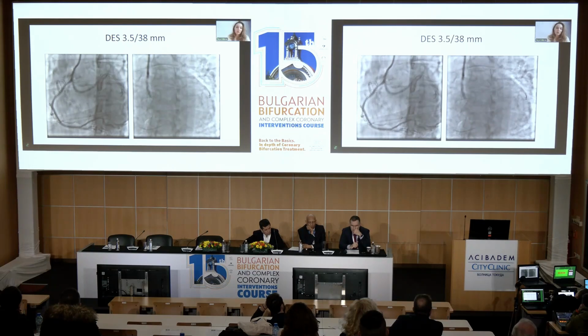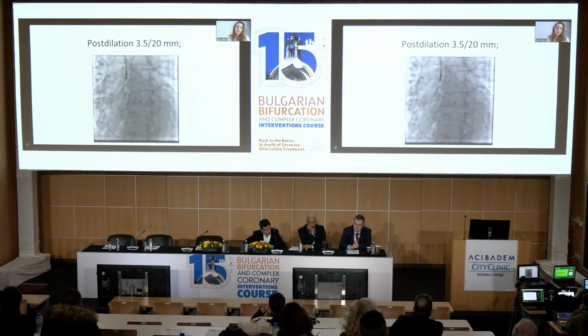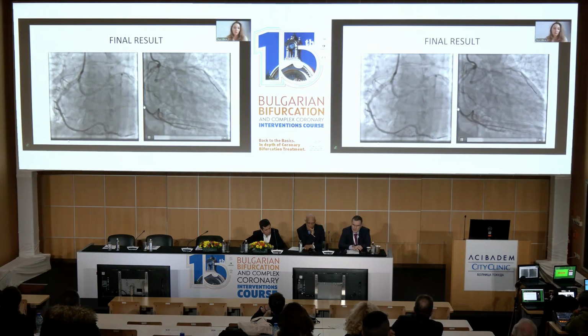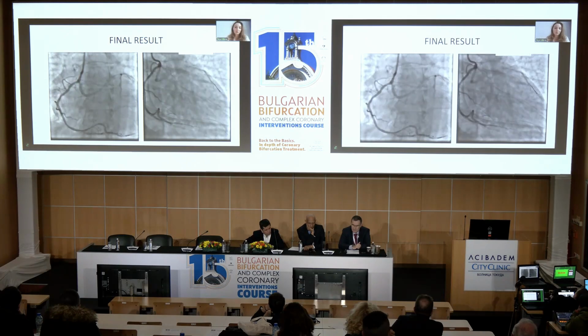They also did post-dilation. However, during this very fast procedure, the patient had recurrent episodes of ventricular fibrillation, and he underwent 13 shocks to restore sinus rhythm. So you can imagine the urgency of this procedure. However, the final result was fine, and the patient is completely okay.